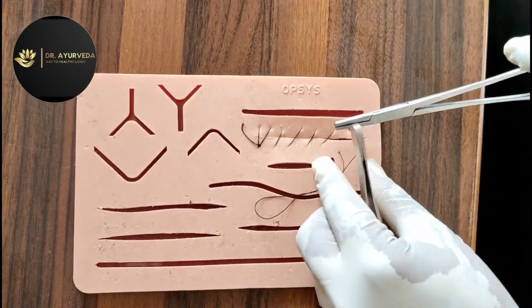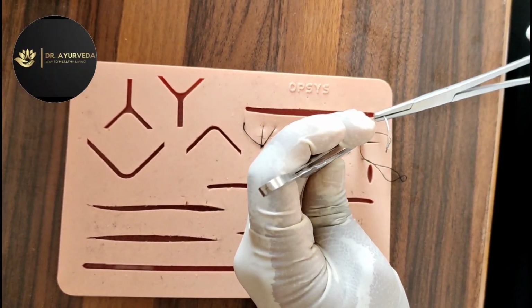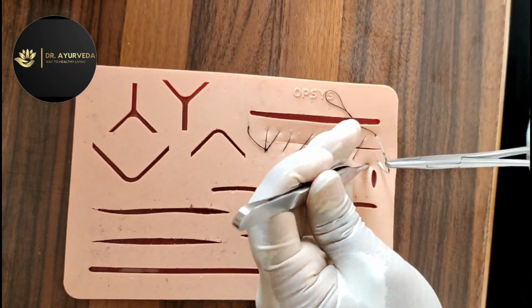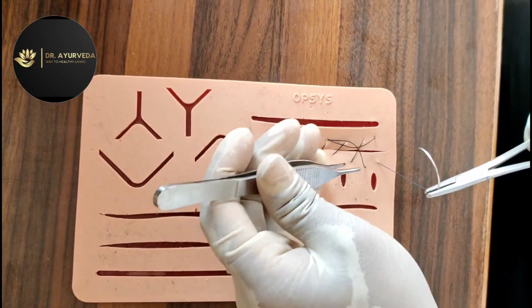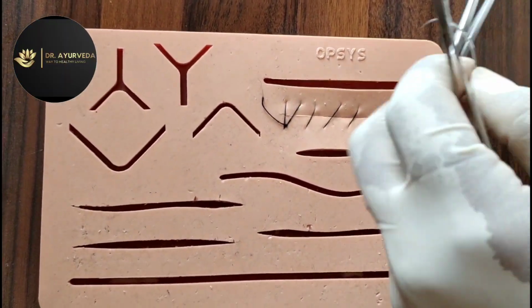When placing a non-locked continuous suture, it is useful to provide a slight tension on the placed suture loop while the next tissue transition is performed. This prevents the suture from loosening in the tissue when performing any additional sutures. The tension may be provided by the surgeon's hand or by the assistant, not by the needle holder.